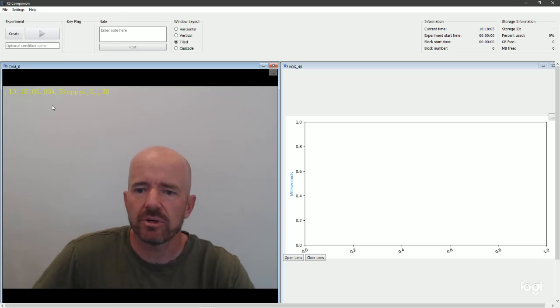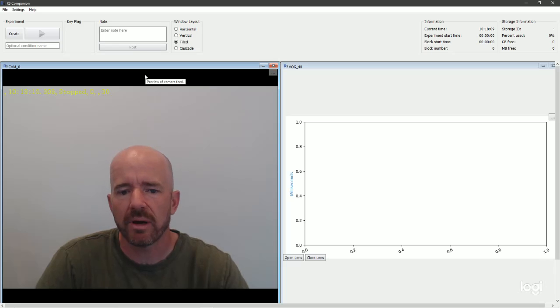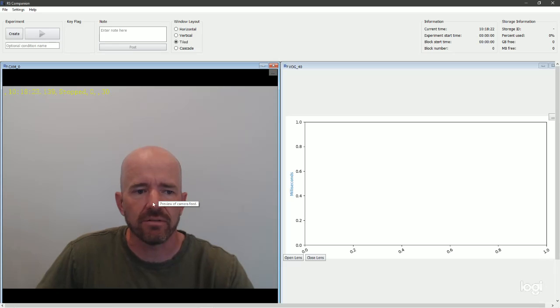So that's pretty exciting. Also supports multiple devices, so you could plug in several pair of occlusion goggles, several DRT devices. You could mix and match, GPS, whatever you choose. And it simultaneously records those data and puts them in a log file for simple analysis.